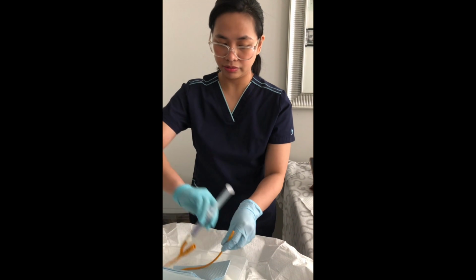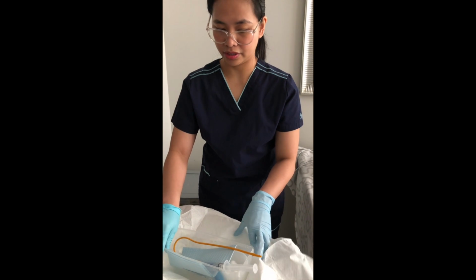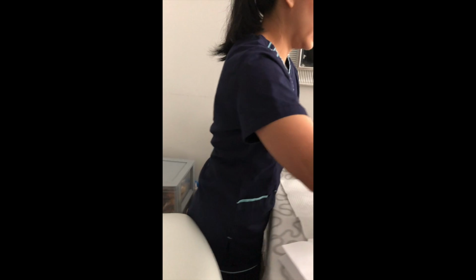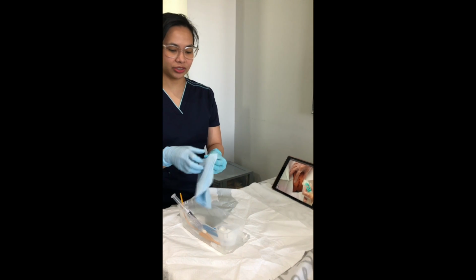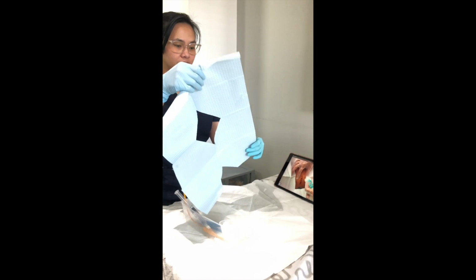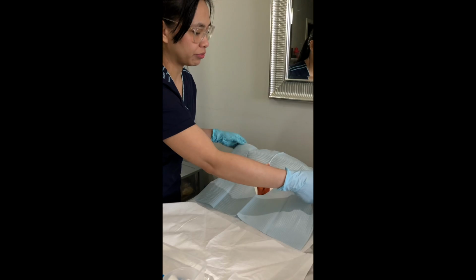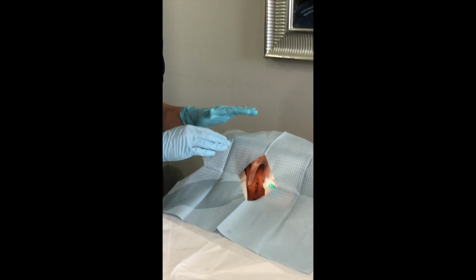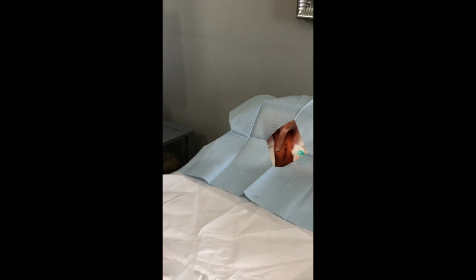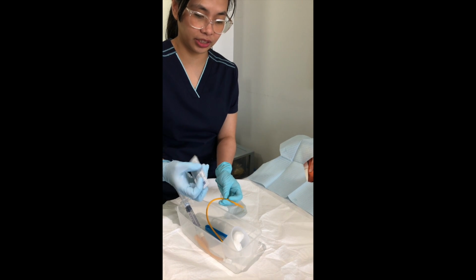Okay, so once everything is here, you can bring this to the patient's leg. So now you can drape the patient using the sterile drape, the fenestrated drape inside the kit. Just make sure not to touch anything beyond, and that you have provided privacy for the patient. You have put a blanket and just exposed the perineum. Okay, and you can now prepare the catheter, lubricate the tip using the jelly.